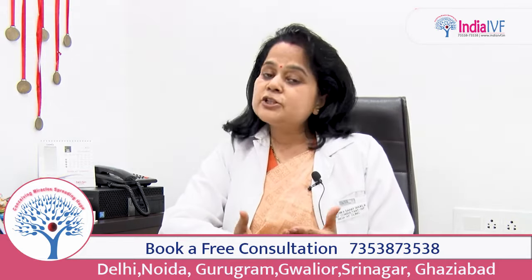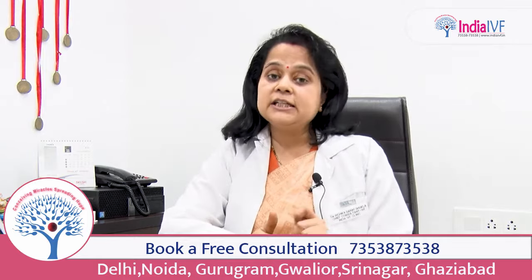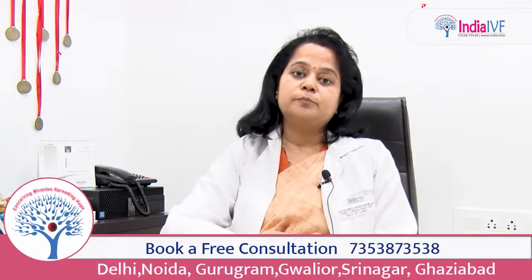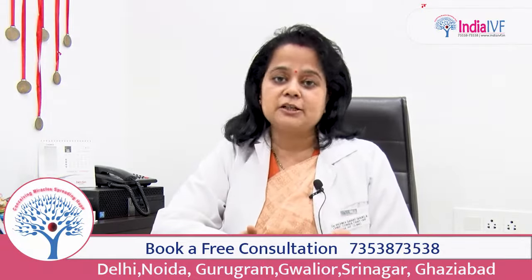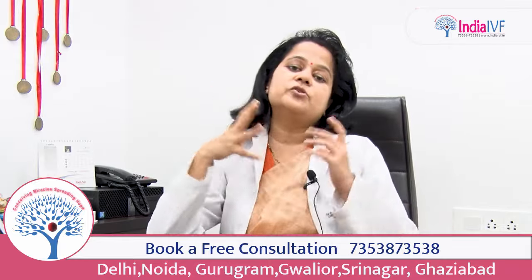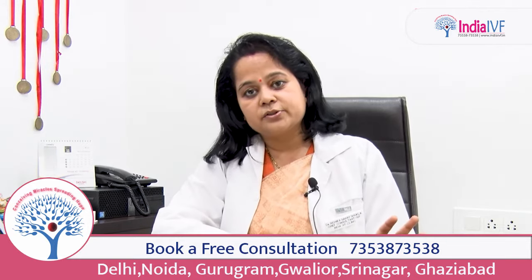Thirdly, even if there is no problem, we can do an endometrial biopsy, take the sample, and send it for further diagnosis to find out what the problem is, why you are having this recurrent implantation failure or recurrent abortions. But nothing is 100% because it is medical science. But obviously that will take us closer to the diagnosis.